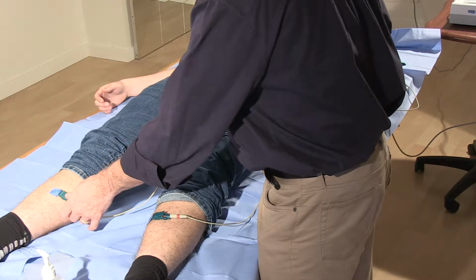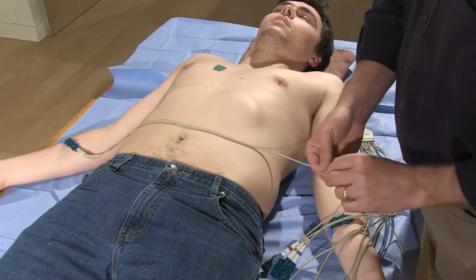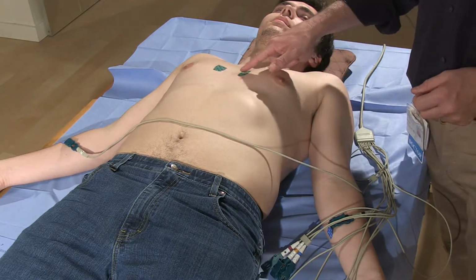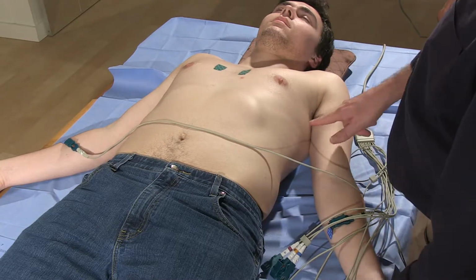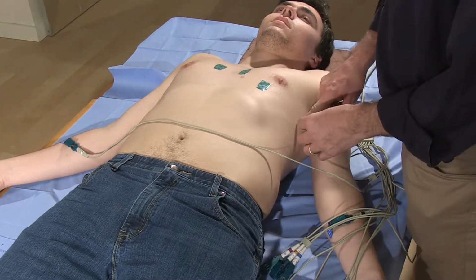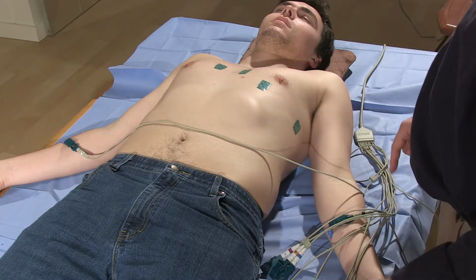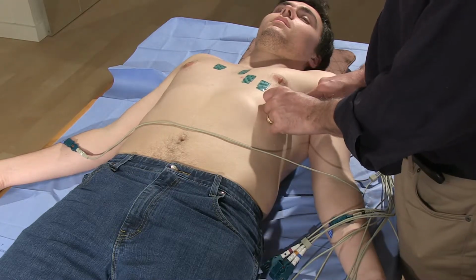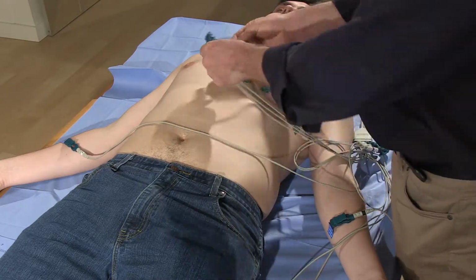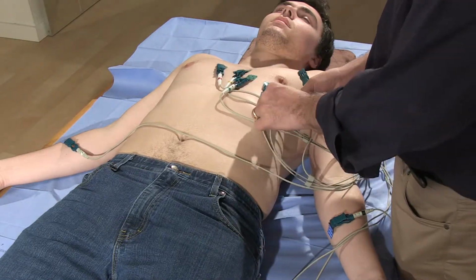Chest leads are placed using specific landmarks. During the performance of the EKG collection skill, the student medical assistant must demonstrate that he or she knows how to correctly count intercostal spaces and how to locate the essential EKG landmarks, such as V1 at the right sternal border, 4th intercostal space, V2 at the left sternal border, 4th intercostal space, V4 at midclavicular line in the 5th intercostal space, and V6 at the mid-axillary line in the 5th intercostal space. V3 is placed midway between V2 and V4, and V5 is placed midway between V4 and V6.